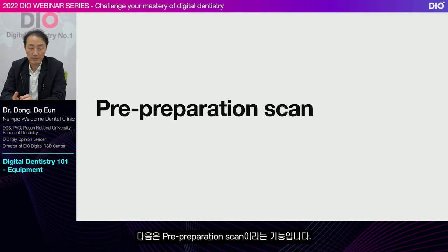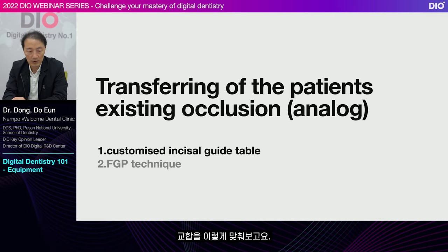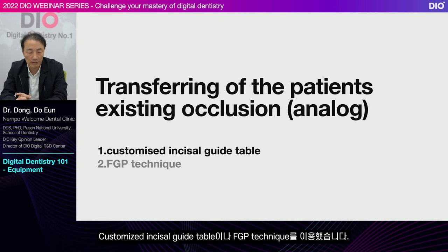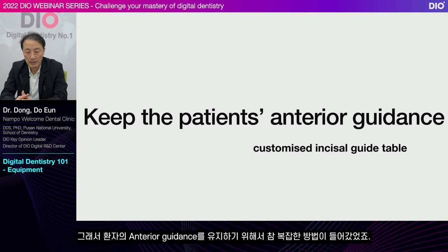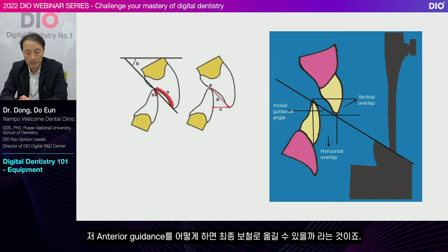Next is the pre-preparation scan function. Test the occlusion like this. And we want to copy the patient's real natural occlusion. If I were using the analog method, I would use a customized incisal guide table or FGP technique. So a very complex method was used to maintain the patient's anterior guidance. So how can the anterior guidance be moved to the final prosthesis?